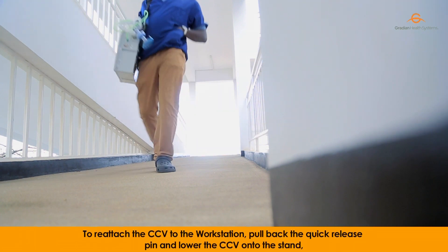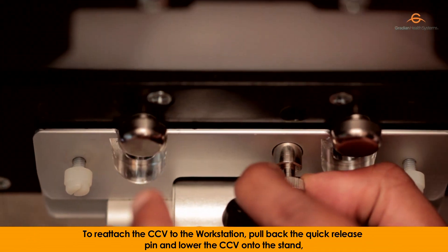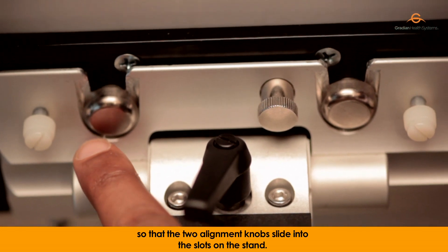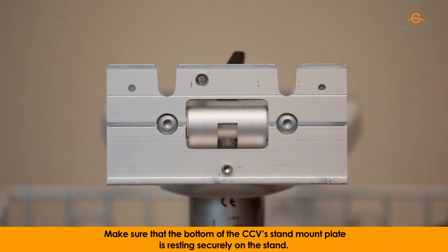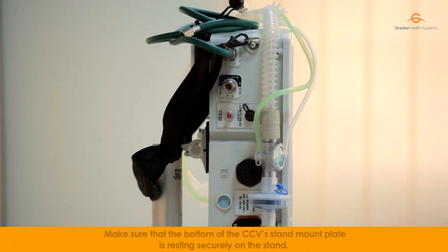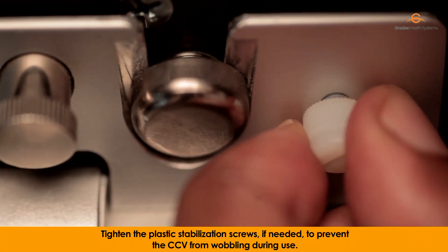To reattach the CCV to the workstation, pull back the quick-release pin and lower the CCV onto the stand so that the two alignment knobs slide into the slots on the stand. Make sure that the bottom of the CCV's stand mount plate is resting securely on the stand. Tighten the plastic stabilization screws, if needed, to prevent the CCV from wobbling during use.